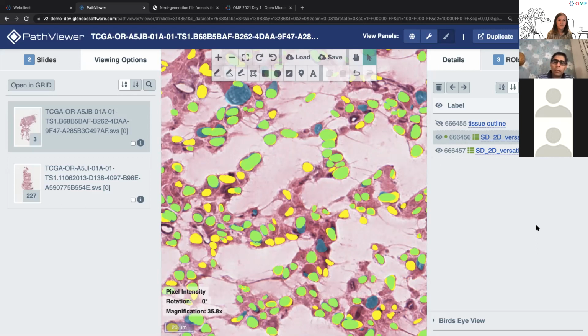I had a question. So you're representing 2D segmentations, but there's nothing in principle that stops this from being used for 3D segmentations? That's right. The OME-ZARR specification, I've been emphasizing X and Y and the downsampling in X and Y, but in fact the OME-ZARR specification and classically the OMERO image is a 5-dimensional object. So it has a representation of both time and Z depth, and multiple channels. We're thinking of these label images as single channel, because each pixel value represents the object ID, so you might have a high bit depth, but you just need a single channel. But they could have a Z dimension and they could have a time dimension.